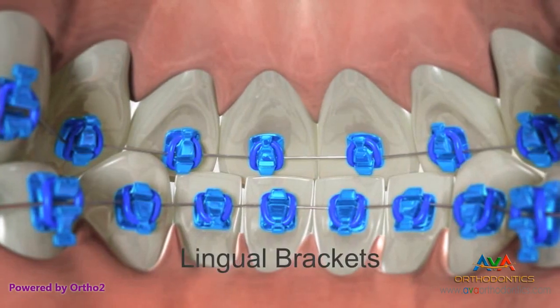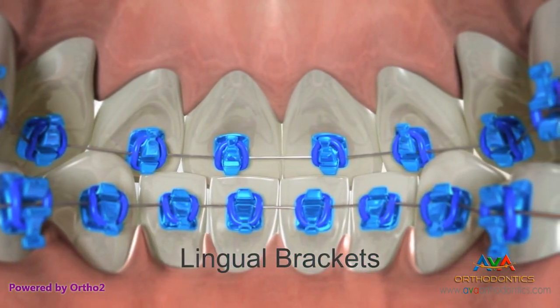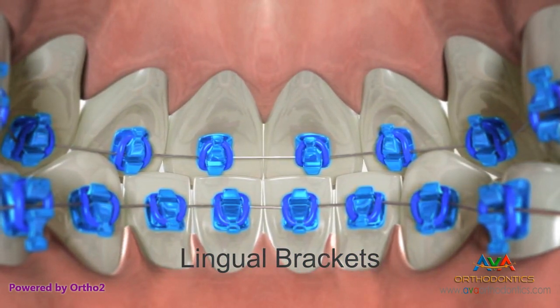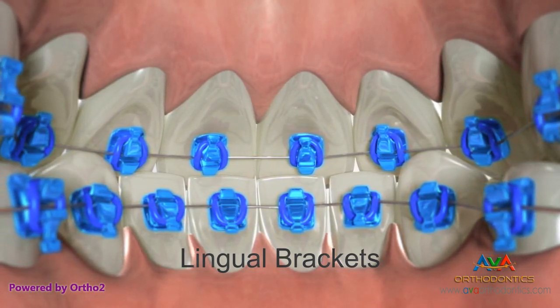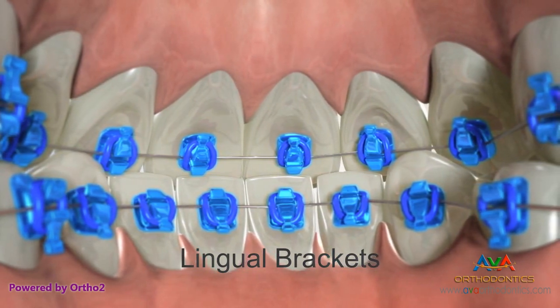Lingual brackets work similarly to twin brackets with one major difference. Lingual brackets are bonded to the inside or lingual surfaces of the teeth. The brackets are unseen from outside the mouth. Some people who need orthodontic treatment and are concerned about how braces may look find this to be a good option.